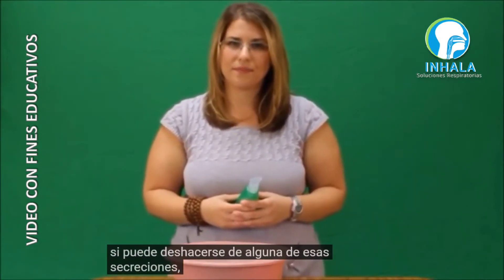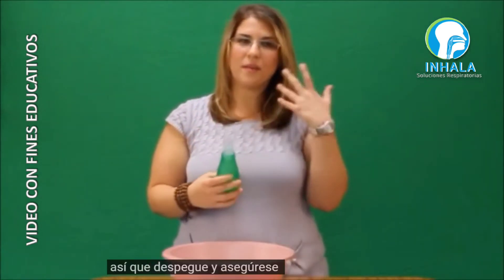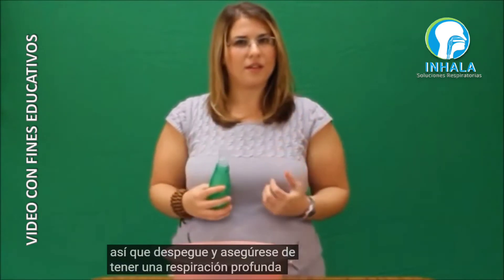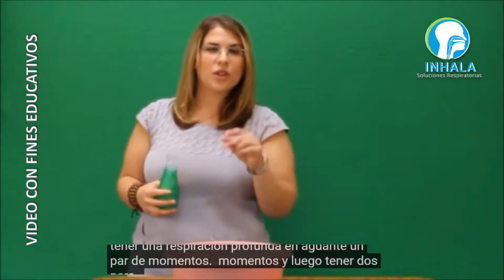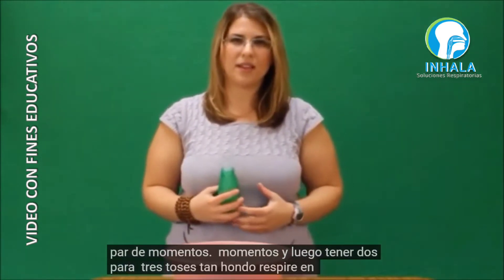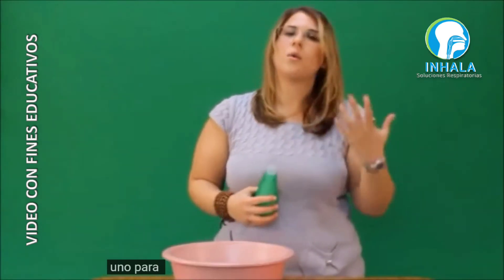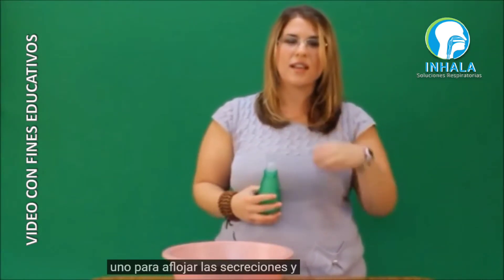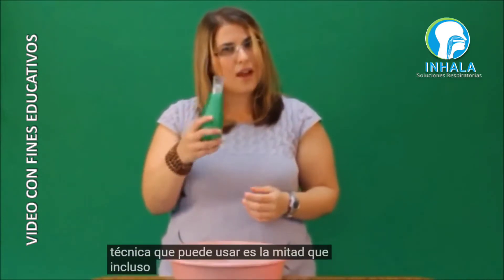To cough, you want to make sure that you take a deep breath in, hold it for a couple of moments, and then do two to three coughs. So: deep breath in, hold — one cough to loosen the secretions and then one to clear the secretions.